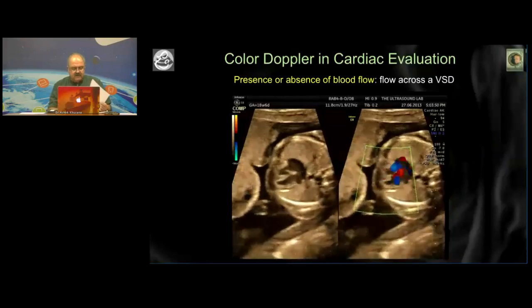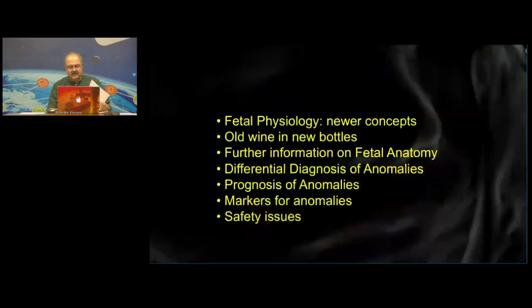Do remember that therefore we have an expanded feature, like I said in the beginning: fetal physiology, a re-understanding of what we use in terms of our conventional Doppler, great new information on fetal anatomy by using flow, a differential diagnosis of anomalies, a prognosis of anomalies, markers for anomalies like the ARSA, and repeat, repeat, repeat, it's perfectly safe. Thank you indeed for your attention.